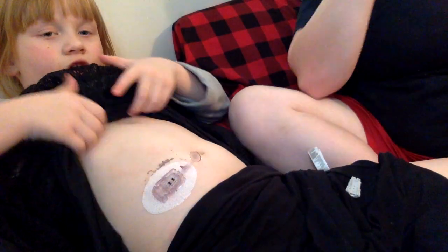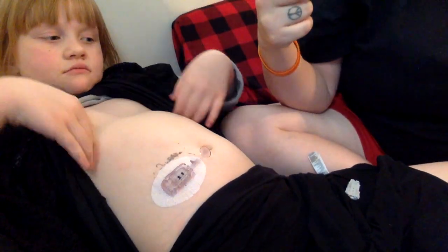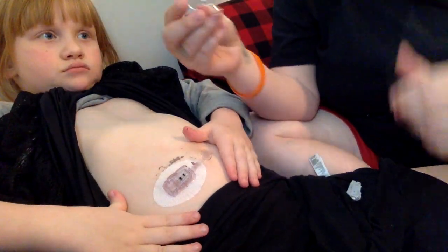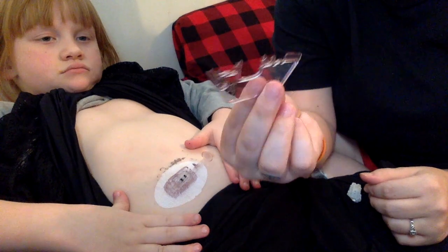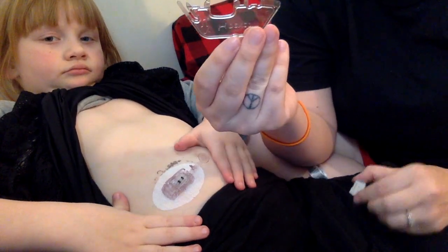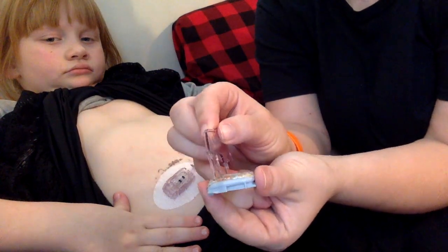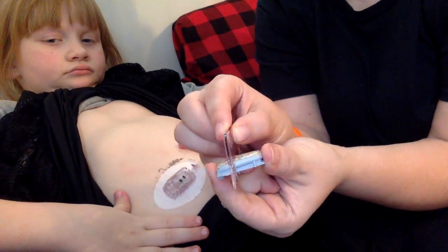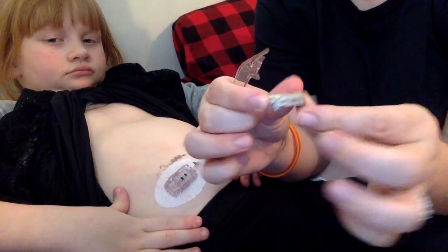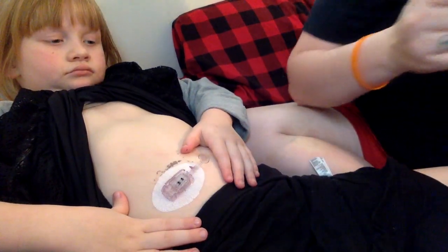Or, what's it called again? It just might be a little dirty. And while that's drying, I'll show you, this is what they give you. This is the safety that we pulled off. But this can also be used to take the transmitter out. You push it down in there and push it through, and it'll pop the transmitter out. But like I said, it's just as easy to me to just pull it on either side. But to each his own.